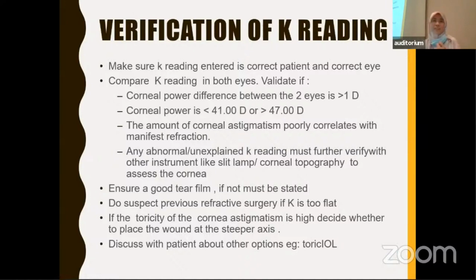Actually I already said this earlier, right? Discuss with the patient and then ensure a good tear film. Do suspect previous refractive surgery if the cornea is too flat. If the toricity of the cornea is high, decide whether to place the wound at the steeper axis. This one, the surgeon doctor will teach later.